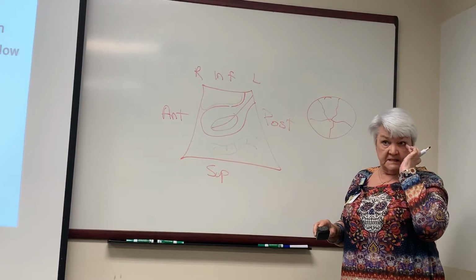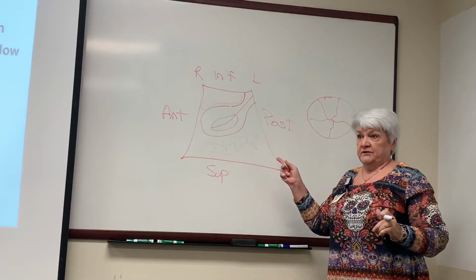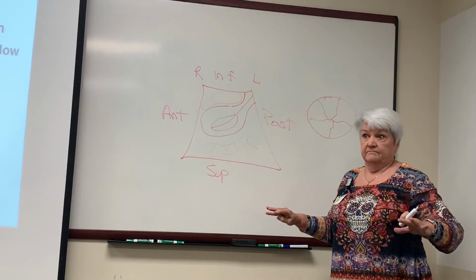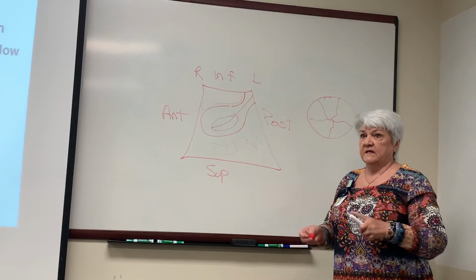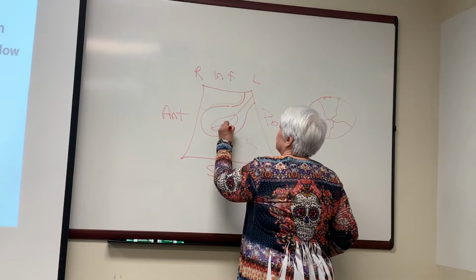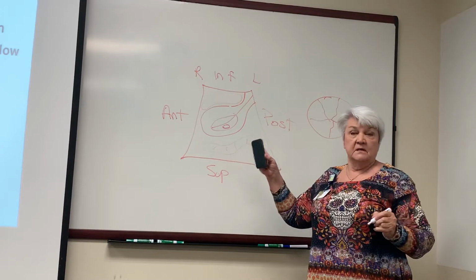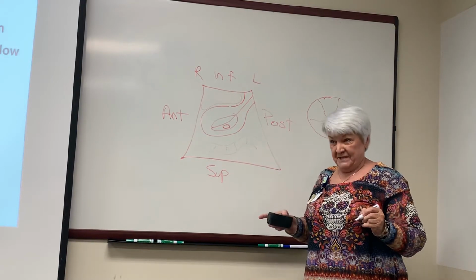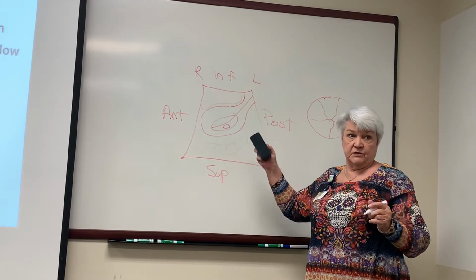Some facilities, like Harris Health System, we used to drink the patients to make sure they had a full bladder. But now we do a transvaginal on everybody. So we don't need that full bladder. We just take what they've got and we take those images. Because what's going to be the first thing that I see is a gestational sac that has 3 names. A gestational sac, an extra embryonic coelom, and a chorionic sac. Those are the 3 names that you're going to see.